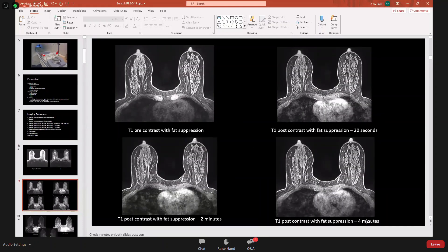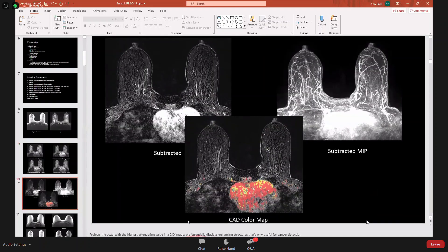Once contrast is injected, a useful teaching tip: if you're unsure whether an image is contrast-enhanced, look at the heart and vessels — if they are enhancing, the patient has received contrast. This can be very helpful when identifying sequences, particularly on an examination like the core exam. Subtracted images — subtracting pre- from post-contrast — along with subtracted MIP images and color mapping help determine what is truly significant in the breast.